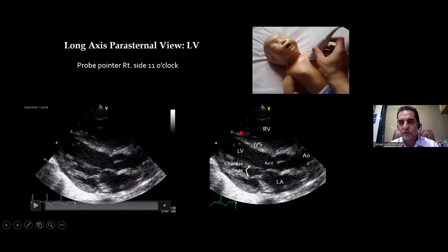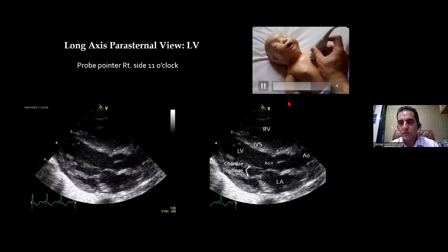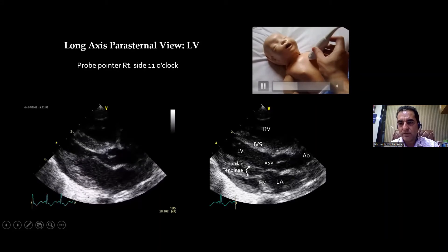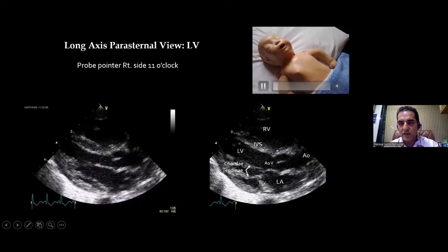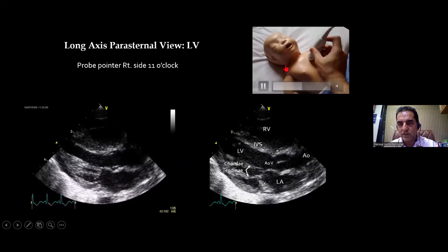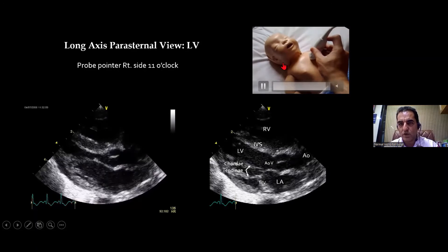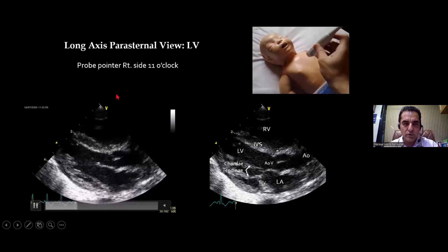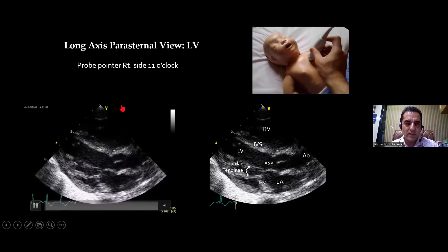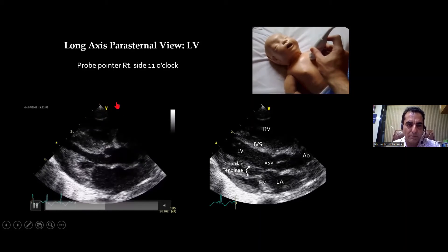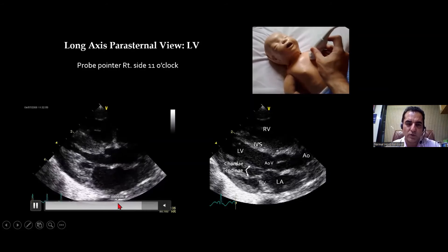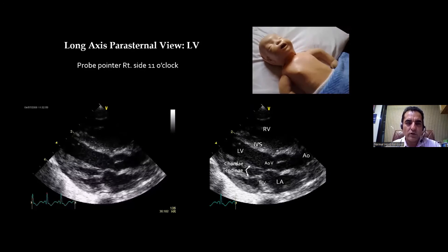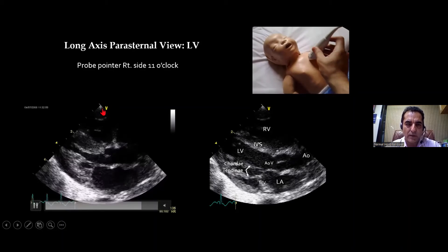As you can see in this video, the probe is being kept at the nipple line — below the nipple line is the low parasternal position. The pointer is pointing at the 11 o'clock position, that is towards the right shoulder. You will notice that the probe orientation marker is now up here, not down — down it was in apical four-chamber and five-chamber views in order to make it anatomically correct and upright.